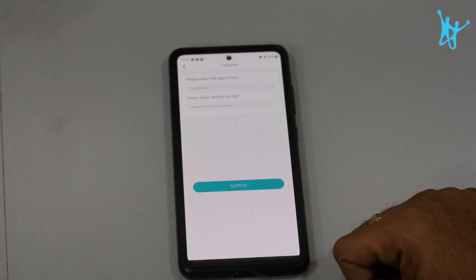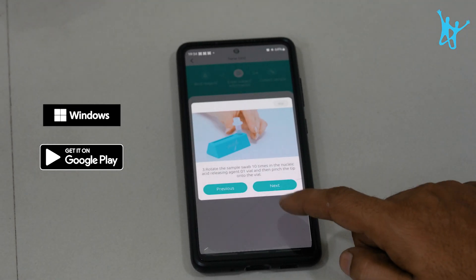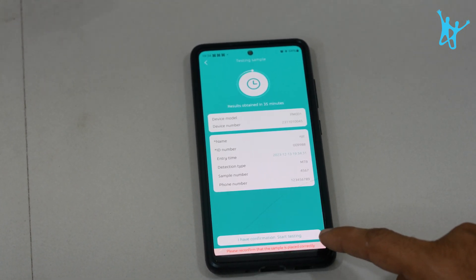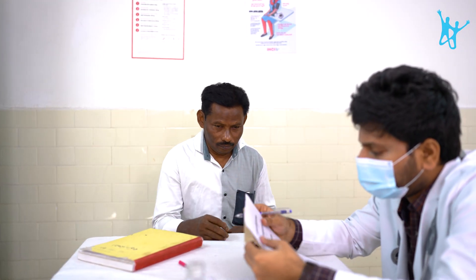UNI-AMP is compatible with both Windows and Android platforms, so it is easy to check the results on the app, take a printout, and share it with the patient. The result helps the doctor make the right call on the course of treatment.